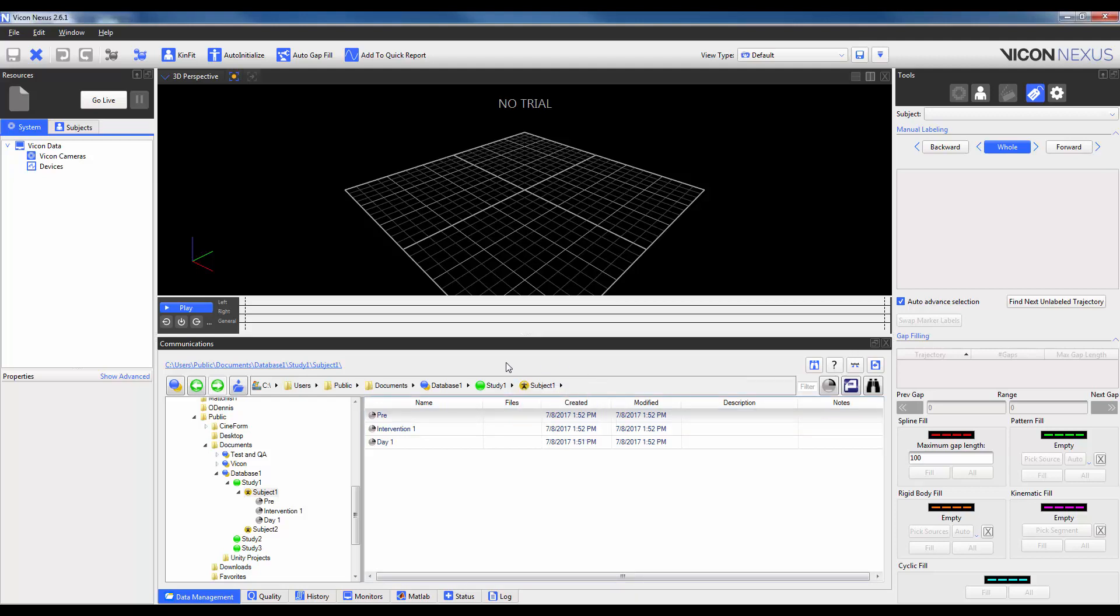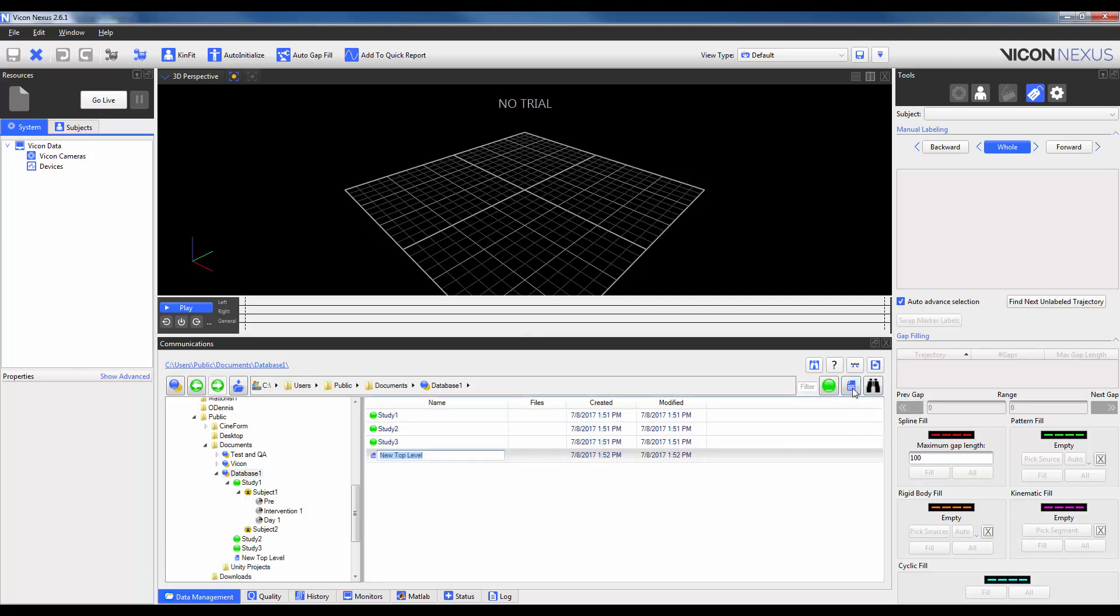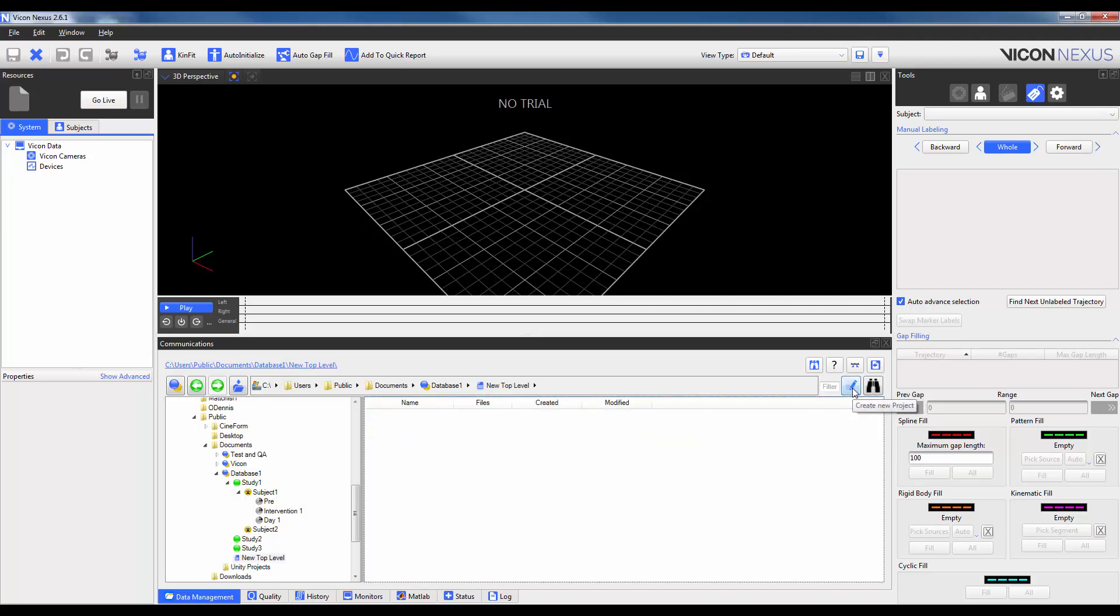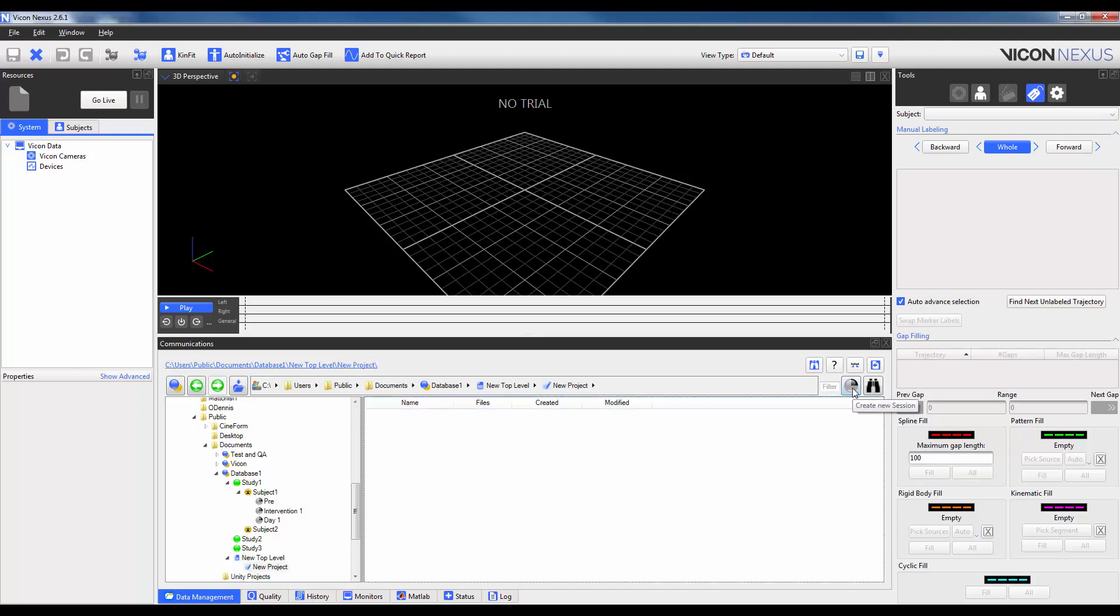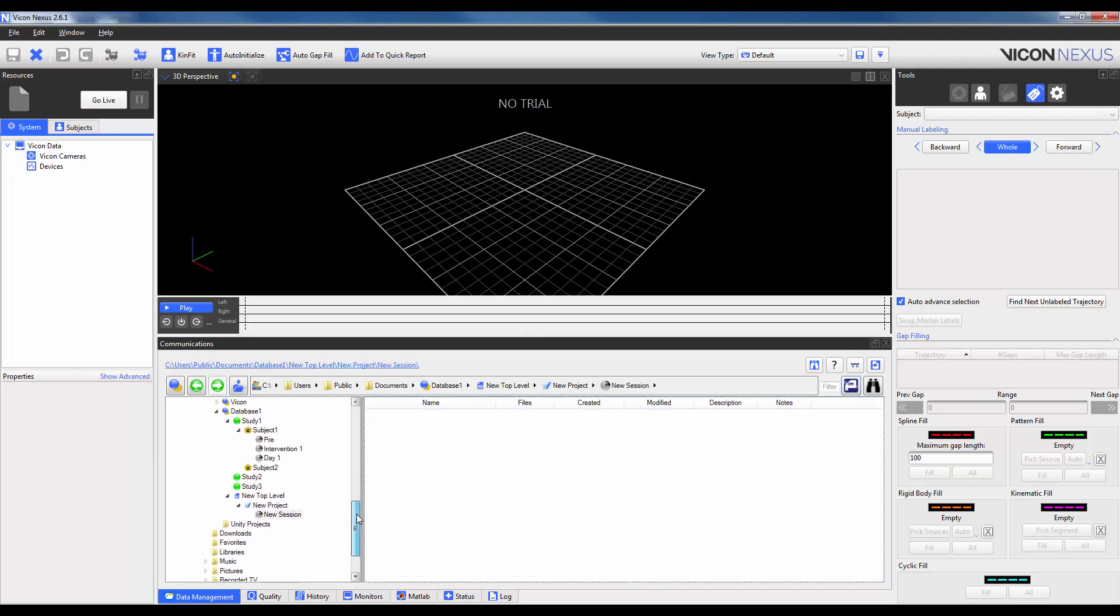I will use this functionality now to go back up to the level of the database so that I can show you the second workflow. This involves creating a new top level instead of patient classification. Within a top level, I'm going to have a new project and then within a project, I'm also going to have a new session. So you can see that the two hierarchies have the same number of levels, just that the names are different. You will also see that Nexus requires an active session to be present in order to record data.